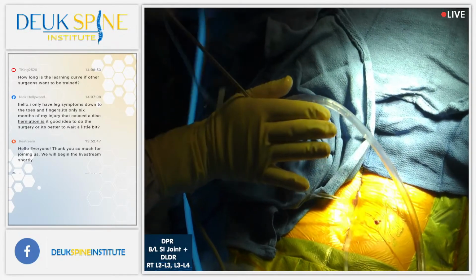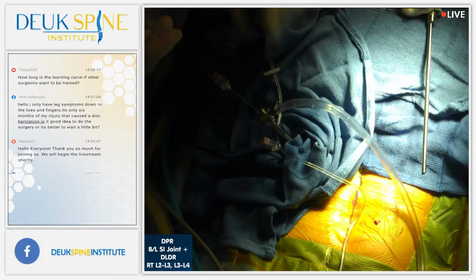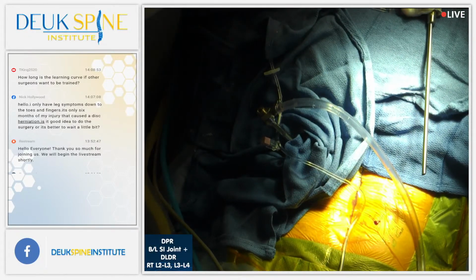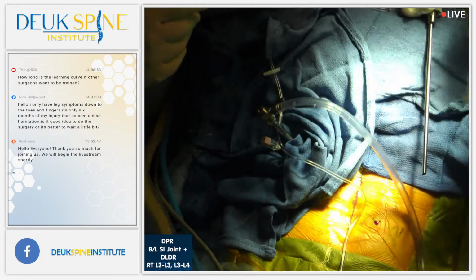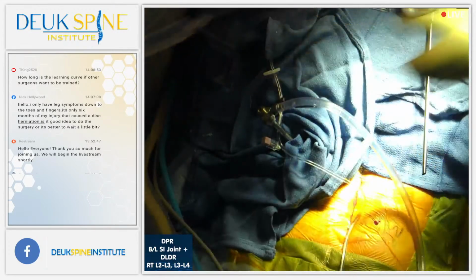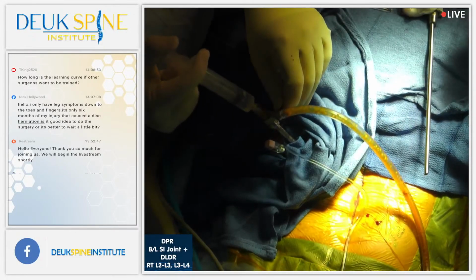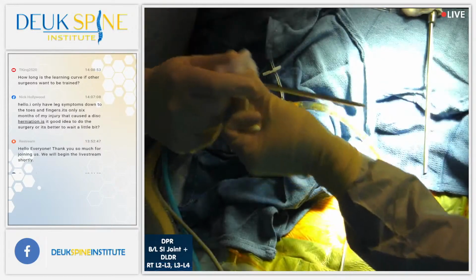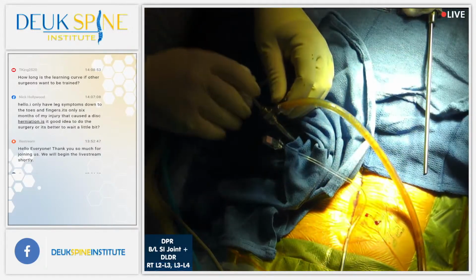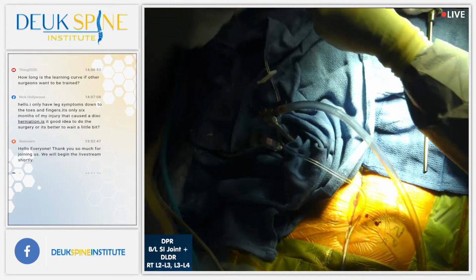Okay, we're gonna irrigate it. Scope off. Nice job, everybody. Little antiseptic irrigation. And then we're gonna move on to the next disc. Yes, sir. We're going to do CPAP. No problem. What is it? Yeah, what is our next case anyway?